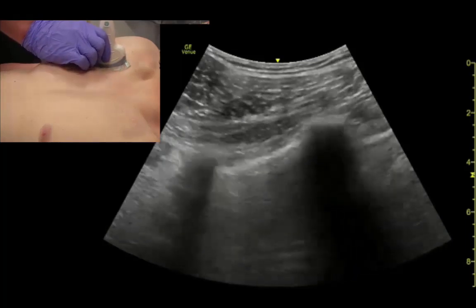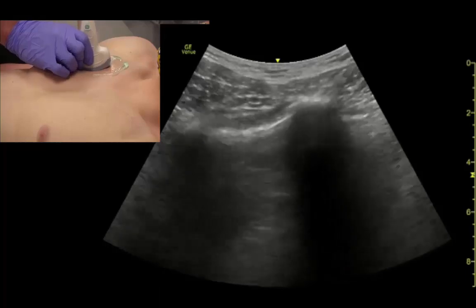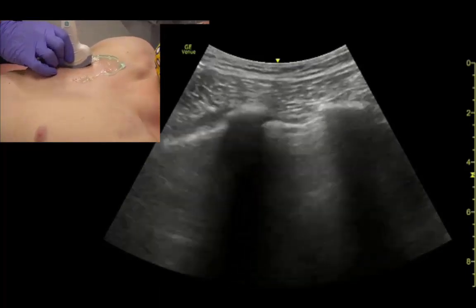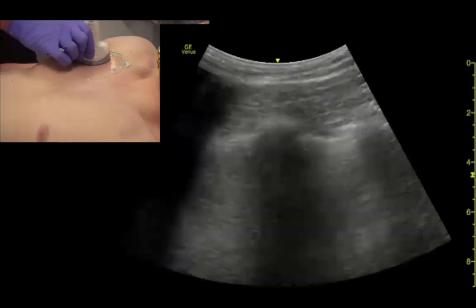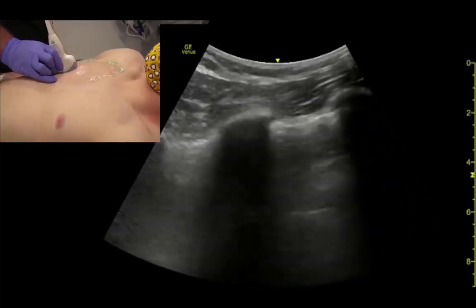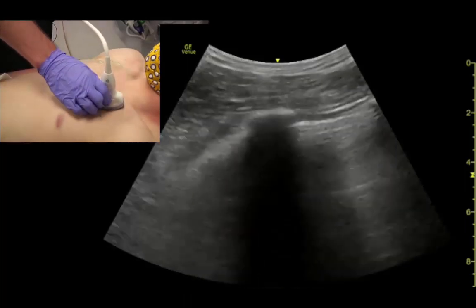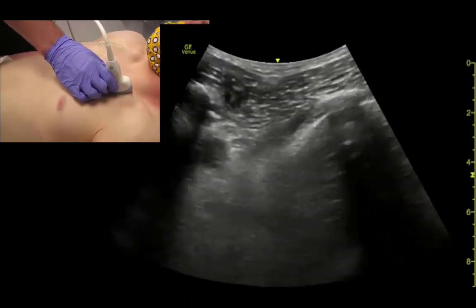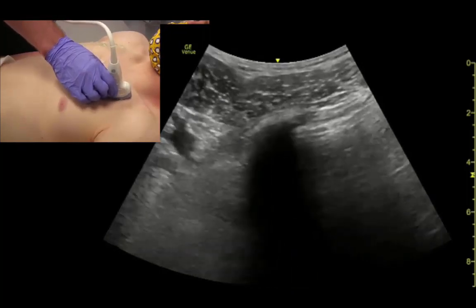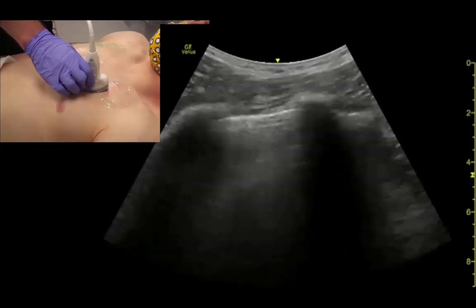And the way I'll examine the lungs is just kind of slowly work my way down and across the front in kind of a lawnmower fashion, some would call it. And the depth is kind of superficial for these anterior fields. So then I'll do the same thing on this side. Again, start up high, identify rib shadows and sliding, and just examine as much of the lungs anteriorly as possible.